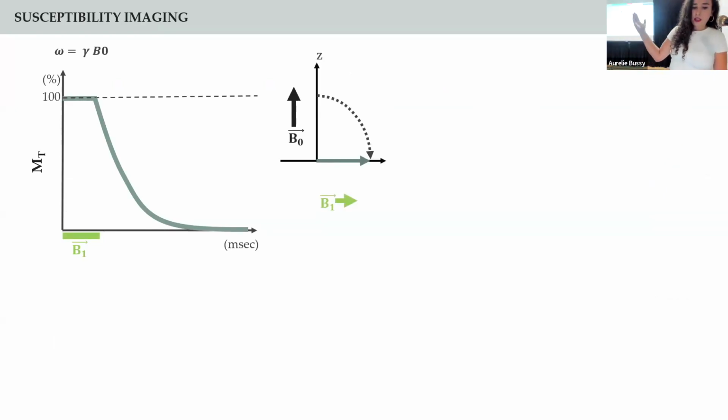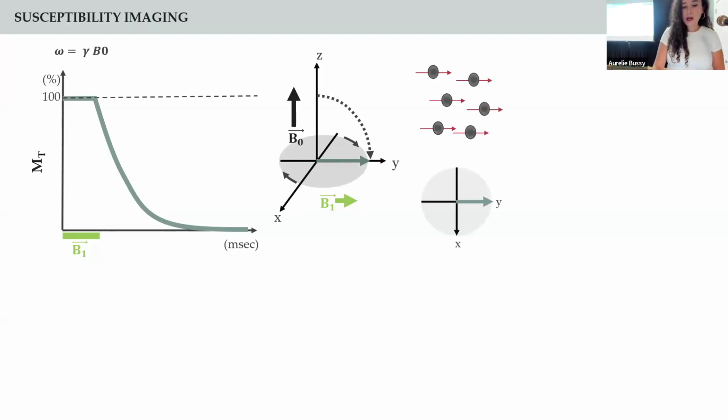Here, I was showing you these types of examples before, but in reality, it's a bit more complex because, of course, it's not a 2D thing happening in the brain, it's a 3D system. So in reality, we also have this x-axis, right, that I kind of dismissed just for conceptual understanding earlier. But you need to know that because this time we are going to really look from the top, and we are only going to look at this XY plane, okay?